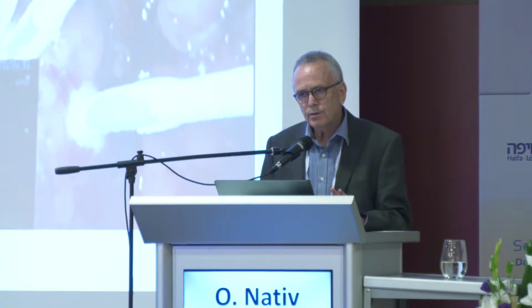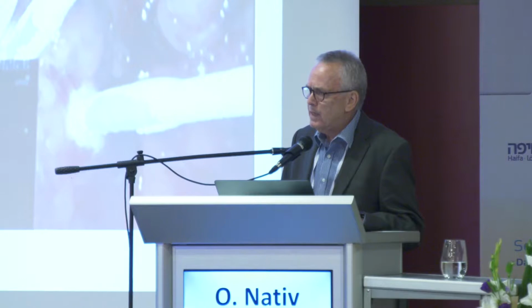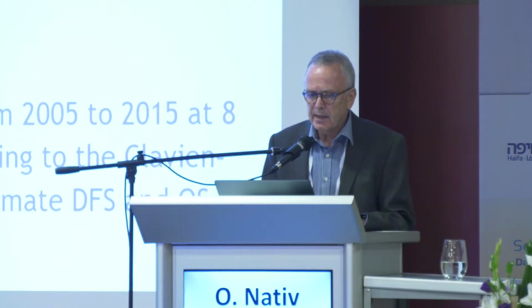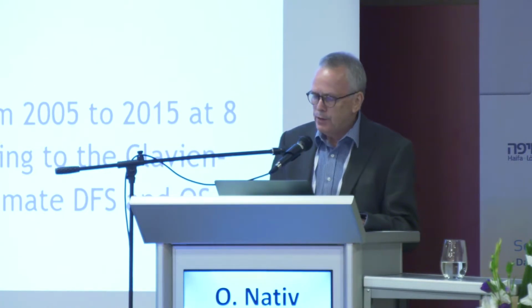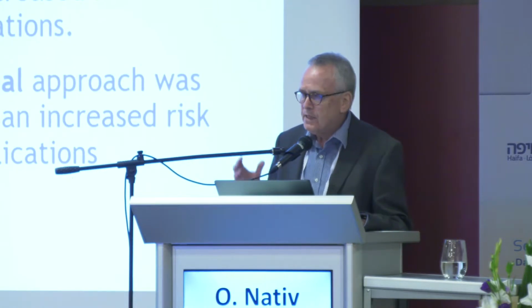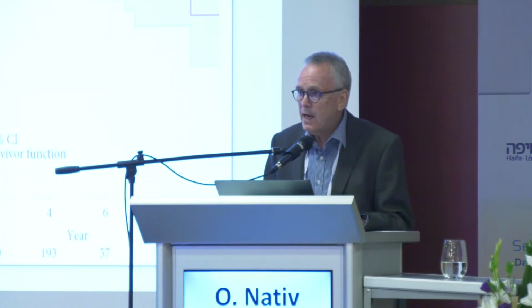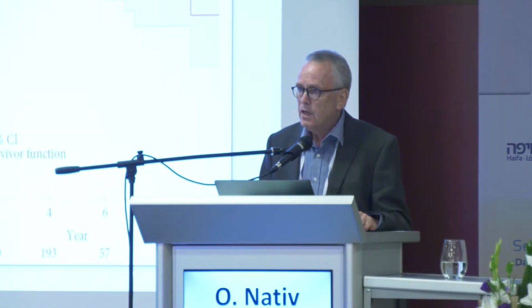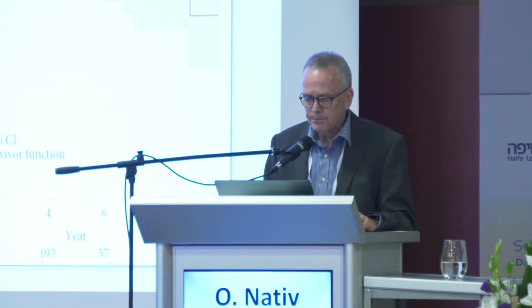Another issue that was not clarified until recently, what is the exact role of cryoablation in treating renal tumor? Well, here is a study coming from the European Registry for Renal Cryoablation, 8 institutions, 800 patients, and what emerged is a high rate of complications. Not only this, look at the results. And if you compare them a few slides before to the Mayo Clinic results, you see here the laparoscopic oncological outcome was not as good.